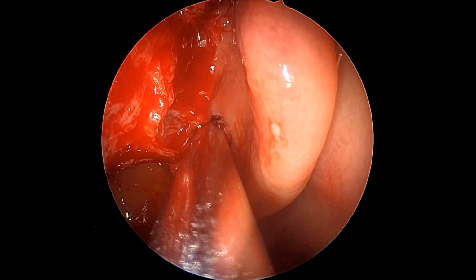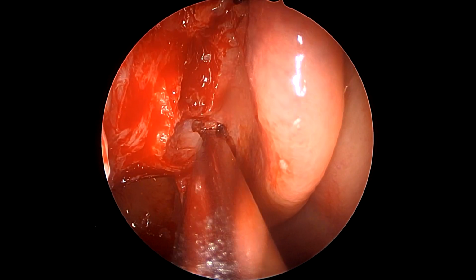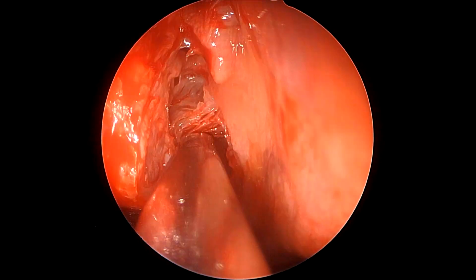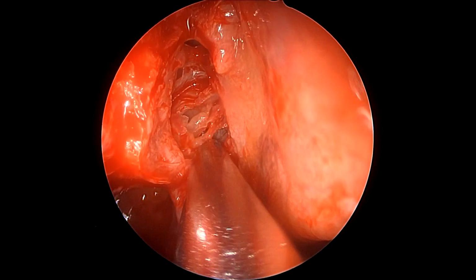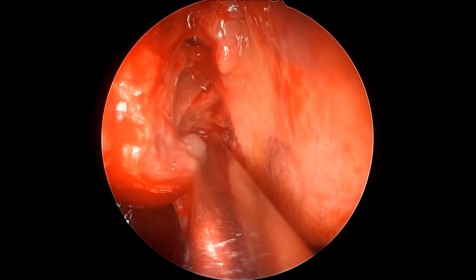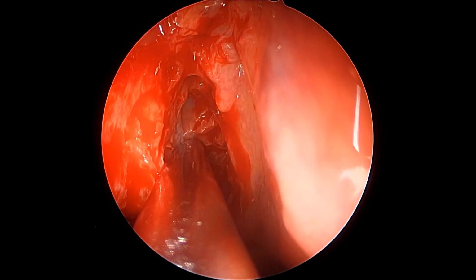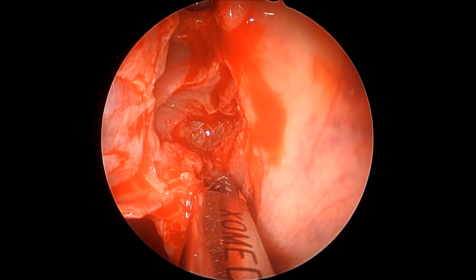Now, as you can see, we are using the same microdebrider blade to puncture the basal lamella, and it is done right at the level of the transitional antrostomy ridge, which is basically the junction between the vertical and the horizontal antrostomy ridge, the horizontal antrostomy ridge being the superior and the vertical ridge being the inferior, that is the posterior wall. Now, as we breach the basal lamella in the medial and the inferior aspect of it, just at the same level as the transitional antrostomy ridge, because that is the safest region, then we start removing the posterior ethmoidal cells gradually, superiorly and laterally. However, in a limited fashion.